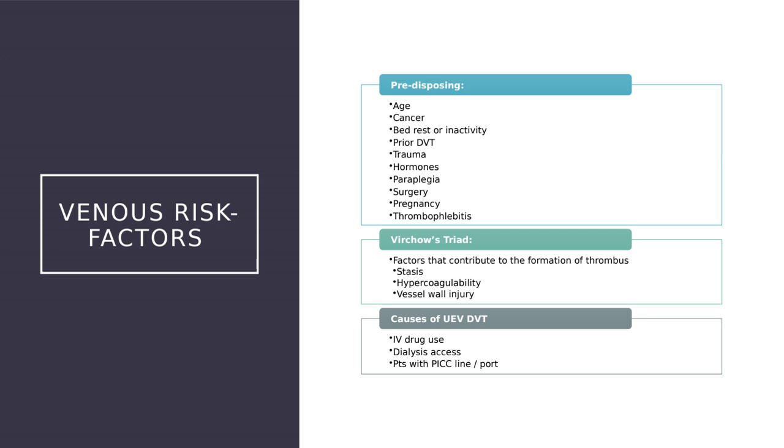It's something that we can kind of tell when we're looking at our worksheet, or rather our work list. It's something that we don't want to ever be judging for. It can make our job harder because IV drug users do use pretty much essentially all of the veins that they can, specifically in their arm. So we can see a lot of that scarring, we can see a lot of that clotting, we can see a lot of that thickened vessel wall, and it can make it really hard for us to find the vein and then therefore evaluate it properly. So things that we kind of just want to keep in the back of our mind.